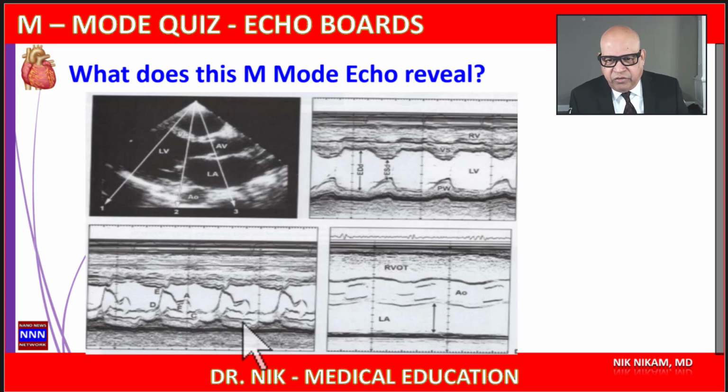Now we can use this one and move the probe a little bit further down, just at the level of the papillary muscle, where we can measure left ventricular dimensions and arrive at the left ventricular size, left ventricular function, and also any evidence for left ventricular enlargement.